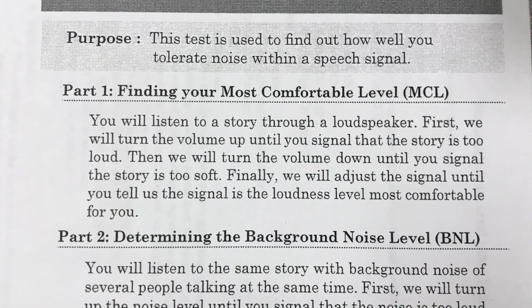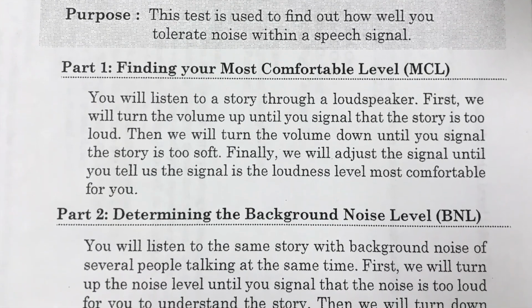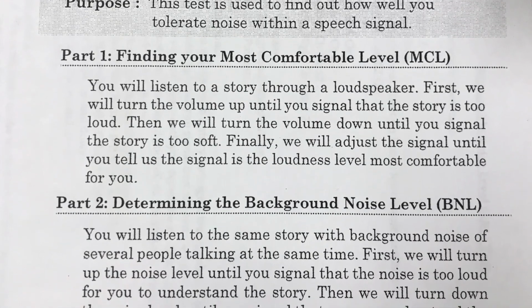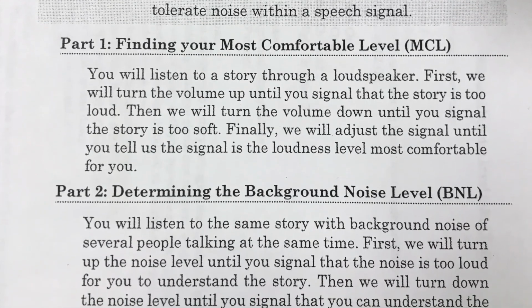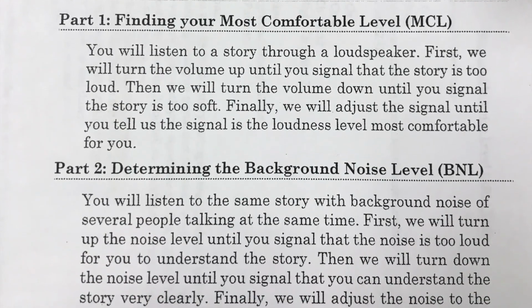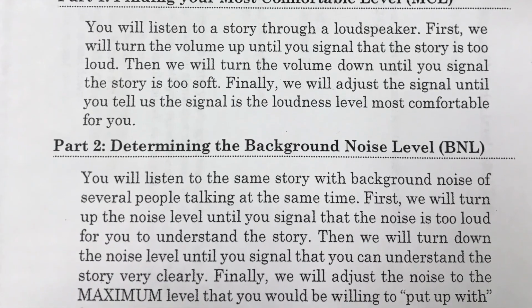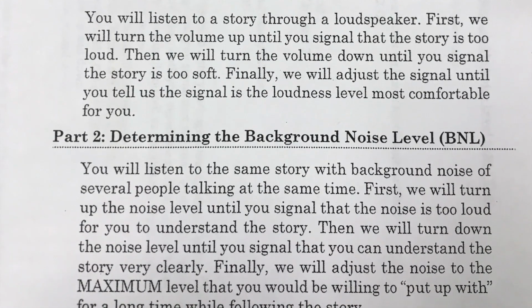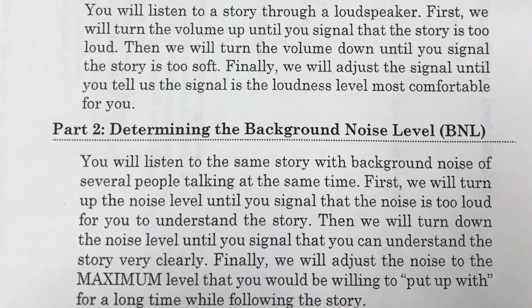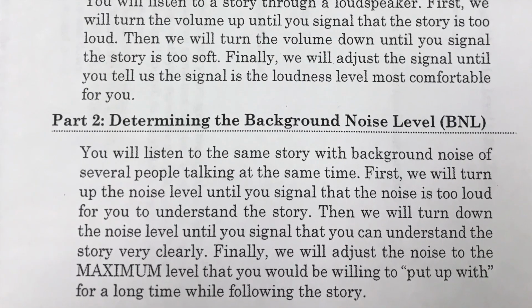You'll listen to the same story with background noise of several people talking at the same time. First, we'll turn up the noise level until you signal that the noise is too loud for you to understand the story. Then we'll turn down the noise level until you signal that you can understand the story very clearly. Finally, we'll adjust the noise to the maximum level that you would be willing to put up with for a long time while following the story.